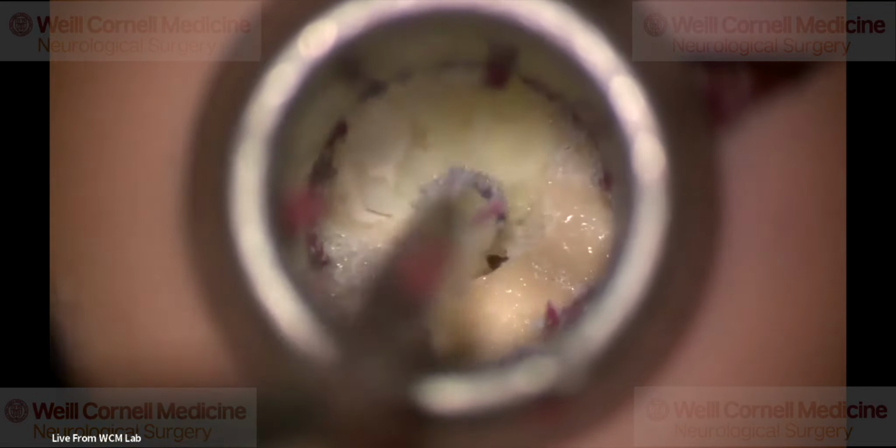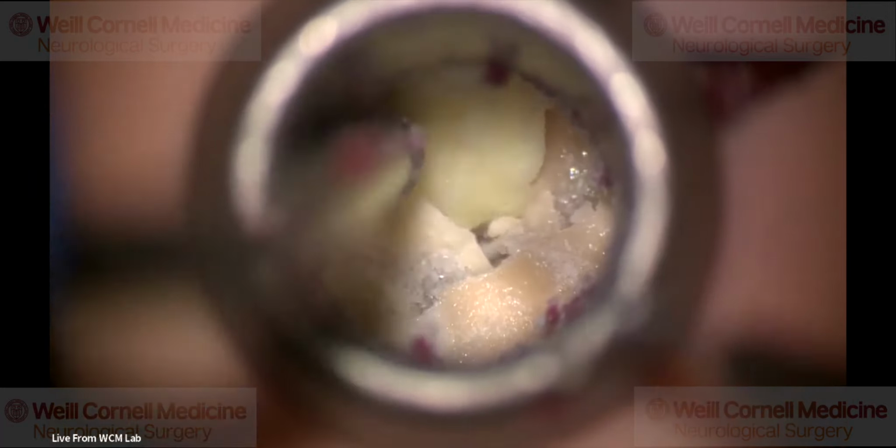See, we got a little bit caught up there. So I'm drilling the medial aspect of the facet. You're doing something here that you do by routine, but I noticed that you put your suction on the midline and you keep drilling. Yes, I always protect with my suction.